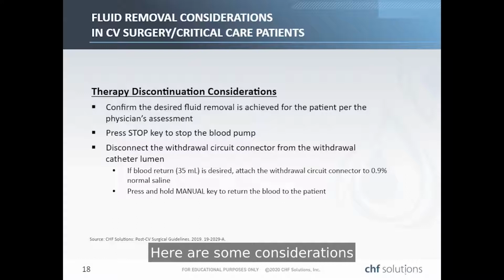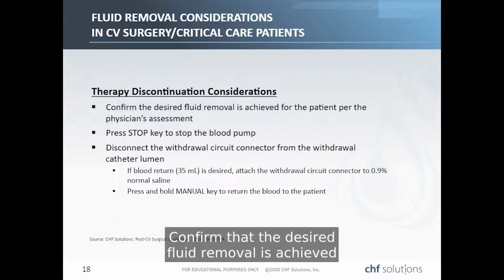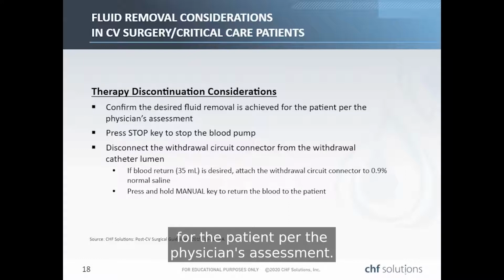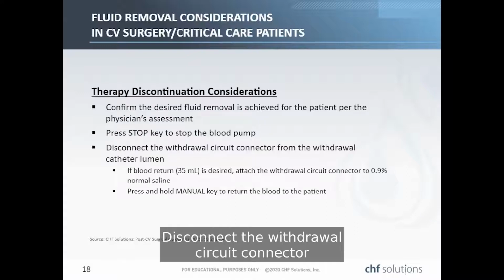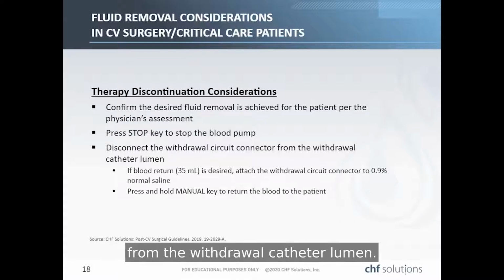Here are some considerations for the discontinuation of therapy. Confirm that the desired fluid removal is achieved for the patient per the physician's assessment. Press the stop key to stop the blood pump. Disconnect the withdrawal circuit connector from the withdrawal catheter lumen.